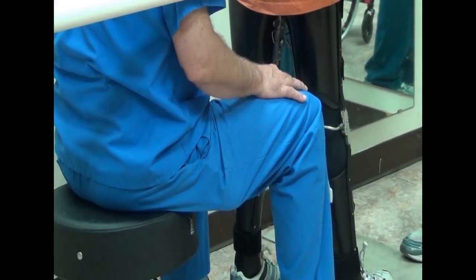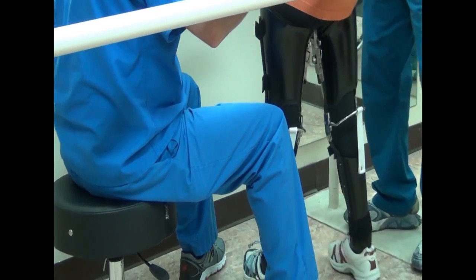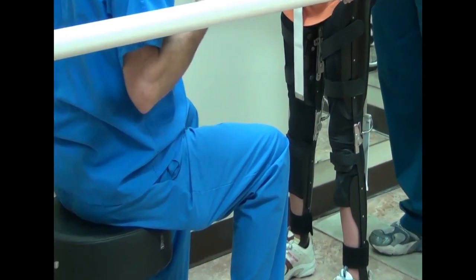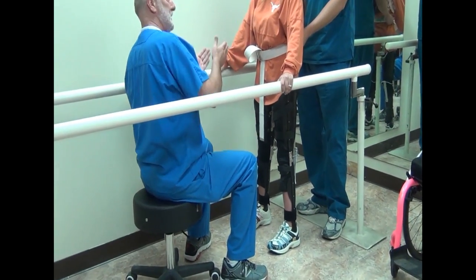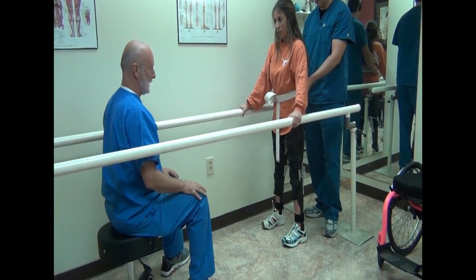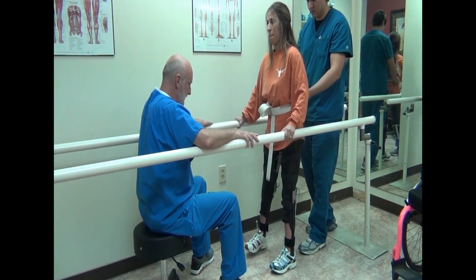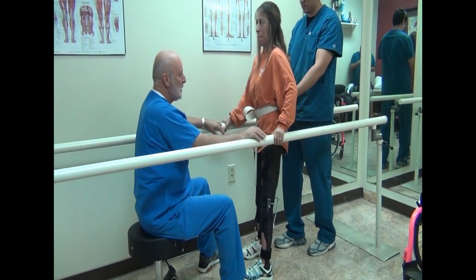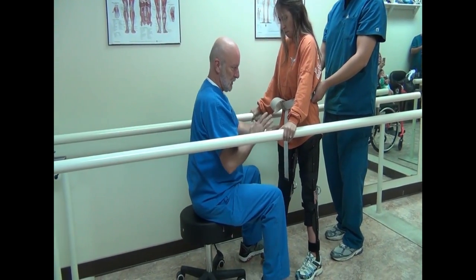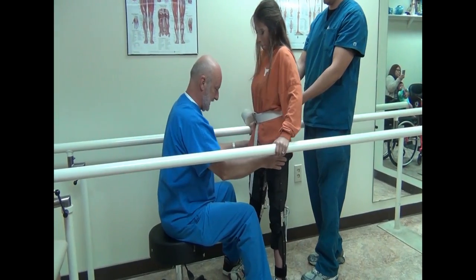You want to go again? One more time — let's see you turn. Upper body strength is important, and now it's all about coordination, weight shifting, and balance, and getting your balance over your feet. You will do better and better really pretty quickly, as young and healthy as you are. With this system there's a little bit of limitation in stride length, so she's not able to take larger steps — but really in this situation we don't want her taking big steps. You notice a lot of pelvic pivoting; that will smooth out as she gets better at this.